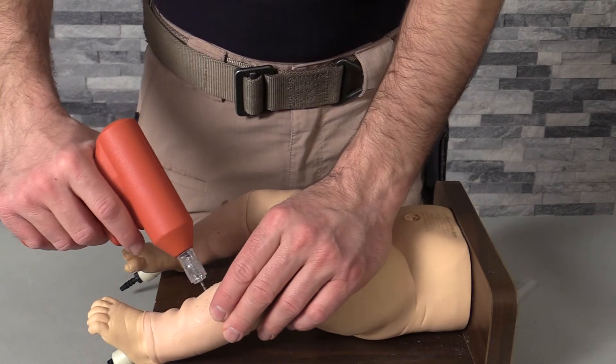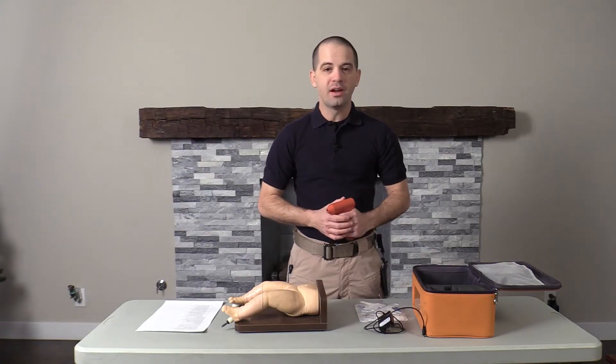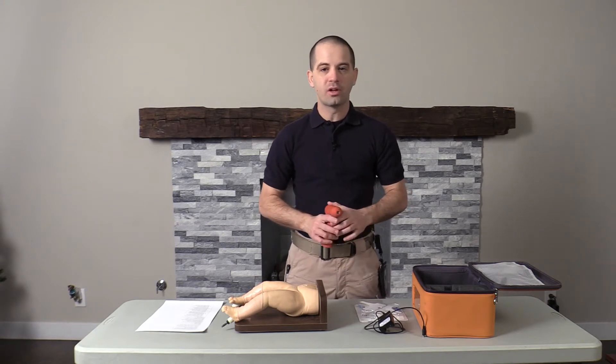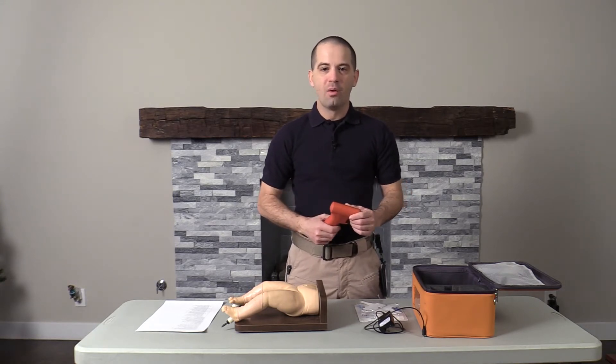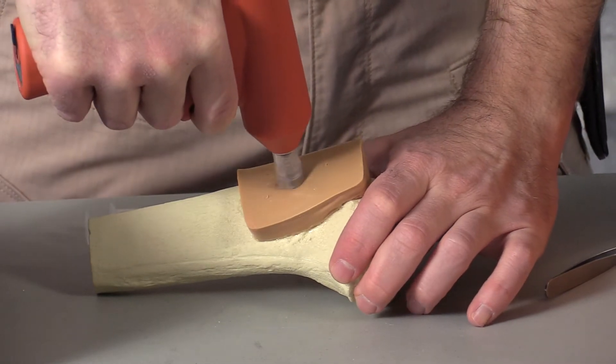So what makes this device so exciting for me? Well, for the longest time, EZ I.O. was the only game in electric I.O. drivers. However, BD is changing that with their new vascular access system.